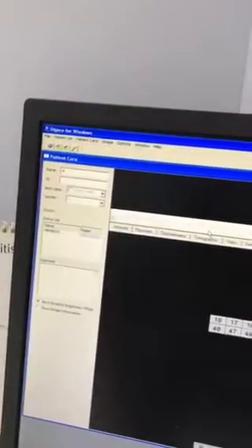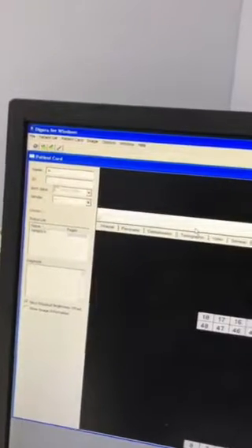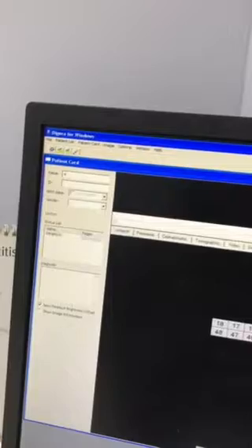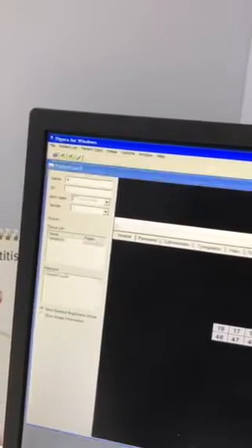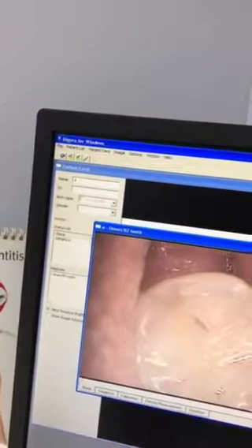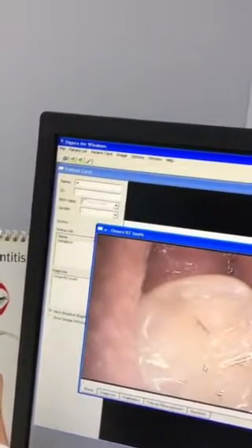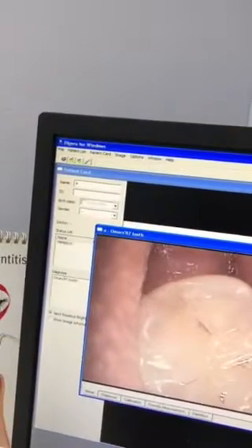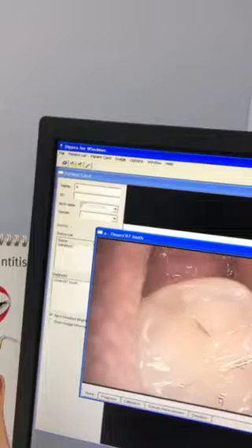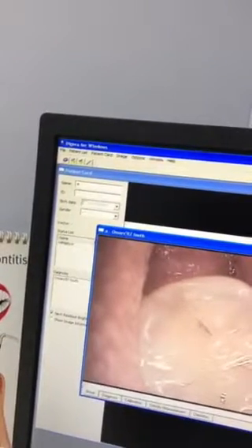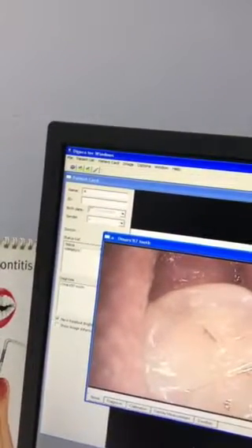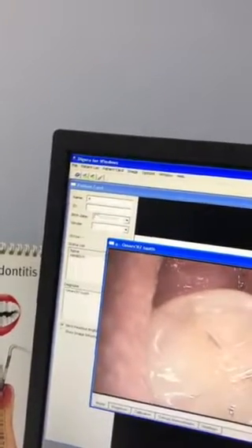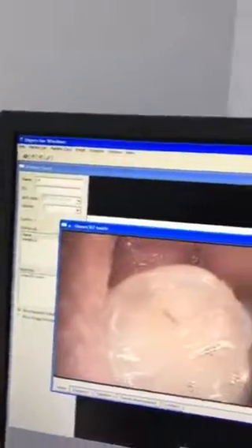The other thing we can do at the practice is take intraoral photos — essentially a photo inside the mouth. This magnifies and shows exactly what's going on, allowing not only the dentist to have a close-up view of the area, but also enabling the patient to understand what's happening with their treatment.